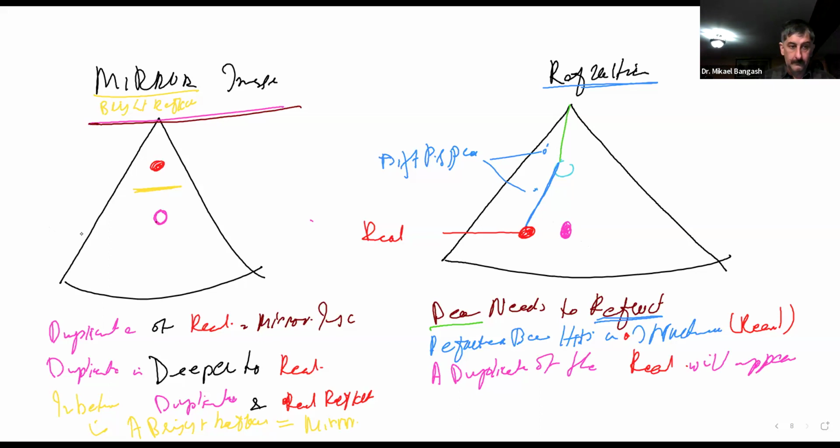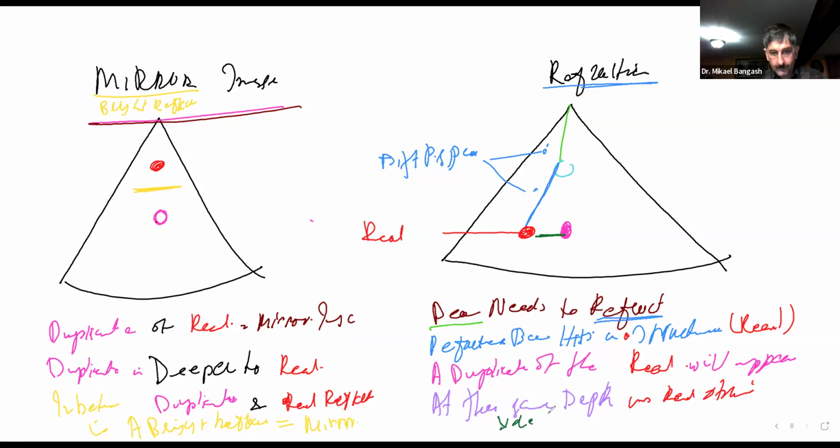And what do we see here? At the same depth as the real structure, or more correctly, side by side to the real structure. So this is going to be your artifact.